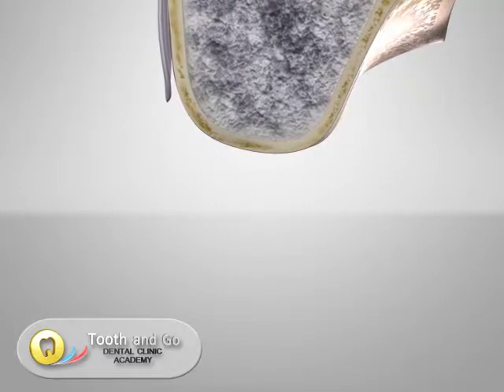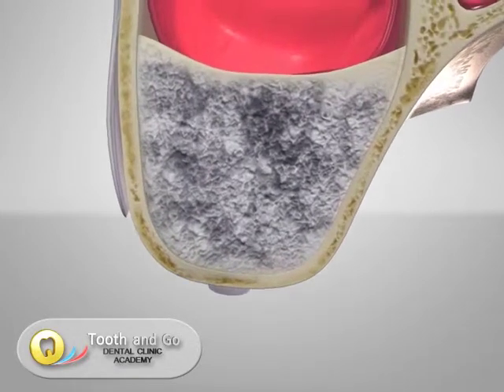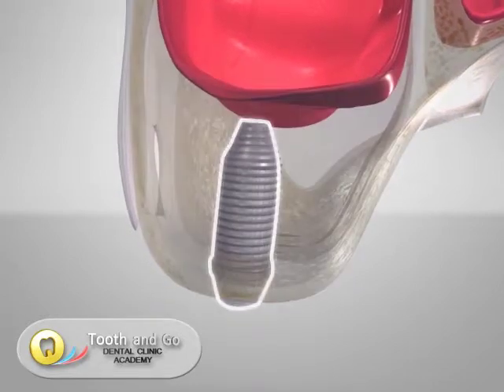Around 4 to 6 months after the procedure, a dental implant can be placed into the newly formed sinus bone.